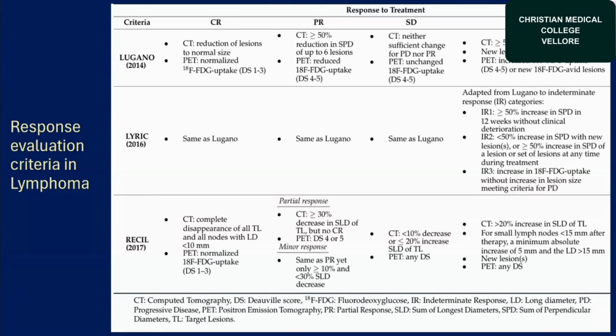So this is just to note that in lymphoma itself, so many criteria have come up, but what we stick to right now is mostly the Deauville scoring and the LYRIC scoring.